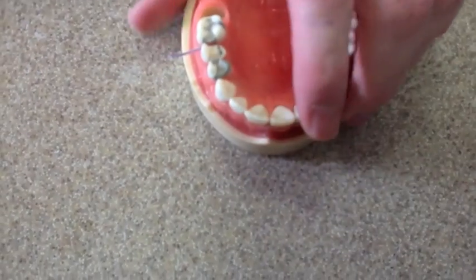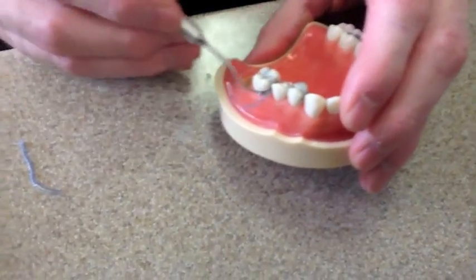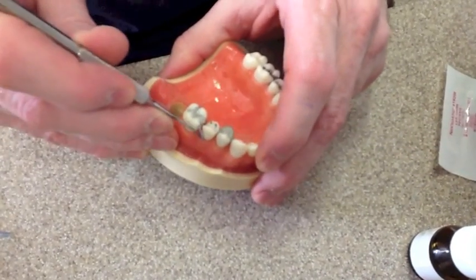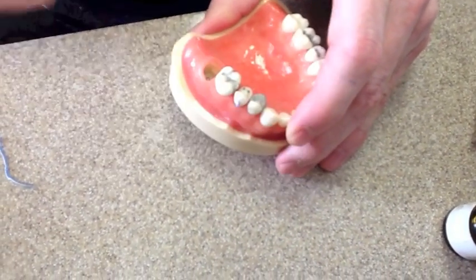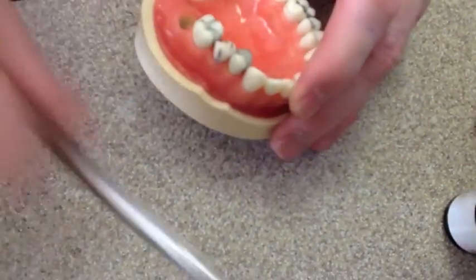Okay, now we're coming back to the front. Now if you remember right, I started about right there. So I need to get this purple back to where I started, about there. Okay, so now that is where I started. I always got to remember where I started.